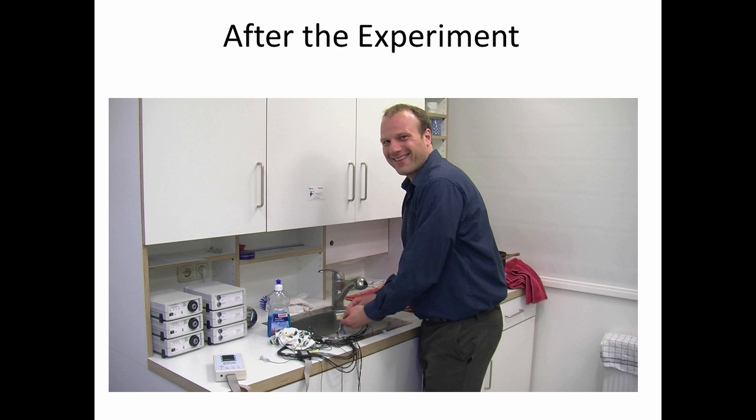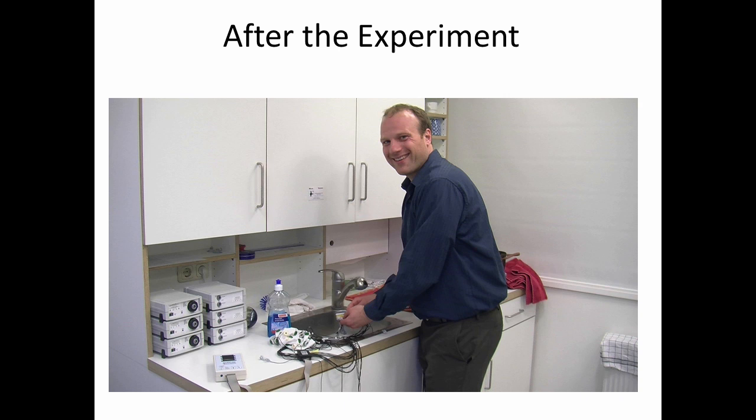After the experiment, we take the participant out of the room and then we debrief them as to the purpose of the study. Finally, we need to make sure to clean all of the equipment to get it ready for the next study, and so here you can see me using a toothbrush with a little bit of soapy water to clean out the electrode gel. That, in a nutshell, is how to run an EEG experiment. Thanks to Katie Cronin and Diana Dimitrova for helping me make this video, and thanks to the Max Planck Institute for Psycholinguistics where this footage was taken.